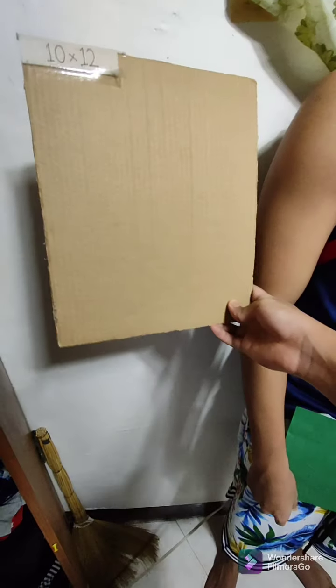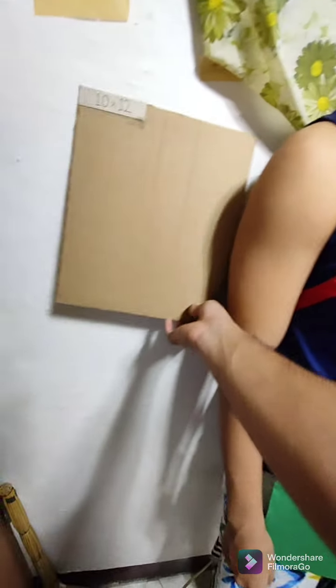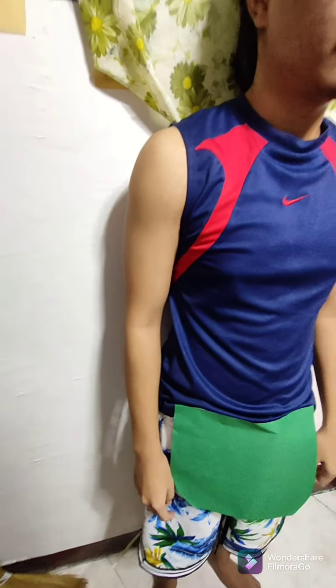So my IR size is 10 by 12 lengthwise. So dito siya banda sa may right banda, assuming na malalagay natin dyan with the corresponding marker. Then next up is to ask the patient to raise his hand. Angat niyo po dyan sir. Then let the patient rest his hand either in the back of his head or in his forehead, depending na lang kung saan mas comfortable ang patient.